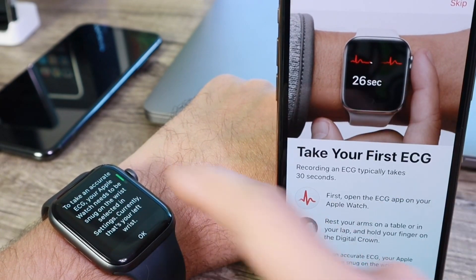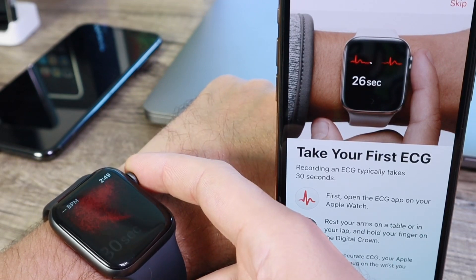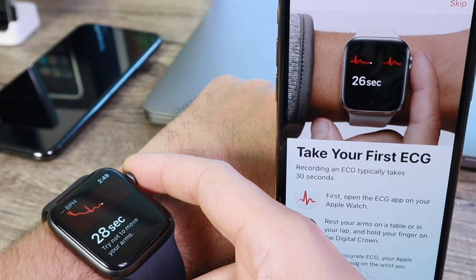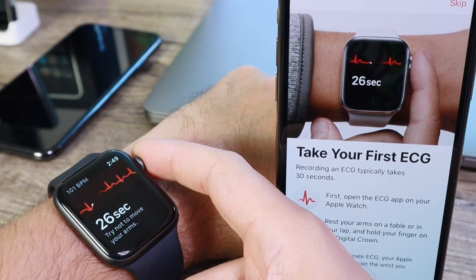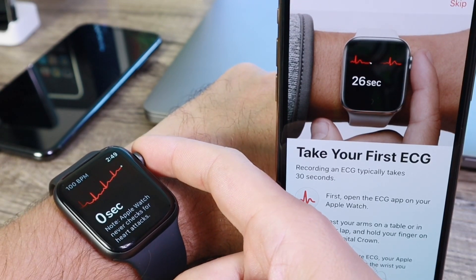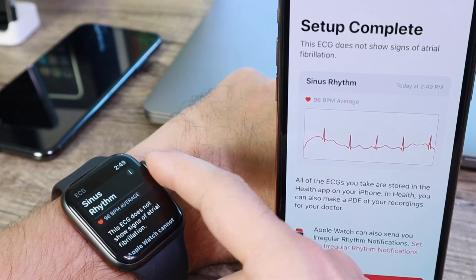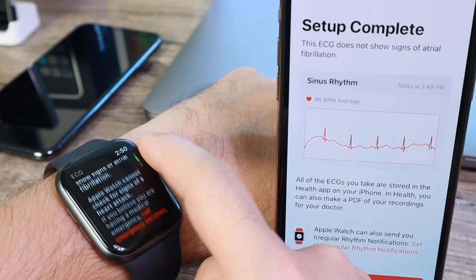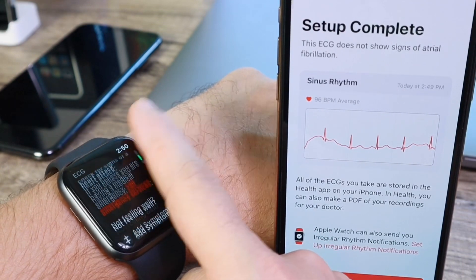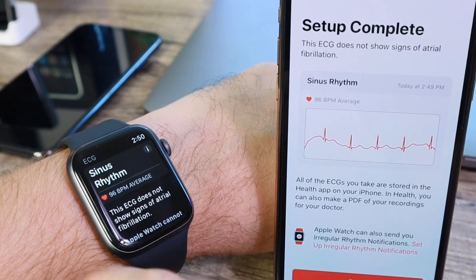We click OK and then put a finger on the digital crown. We're going to wait 30 seconds for the test to complete — I'll fast forward through this part. And there we go — you just witnessed my first ECG. I have the sinus rhythm, which is typically a normal rhythm pattern for the heart, so it looks like I'm okay based on this ECG test.